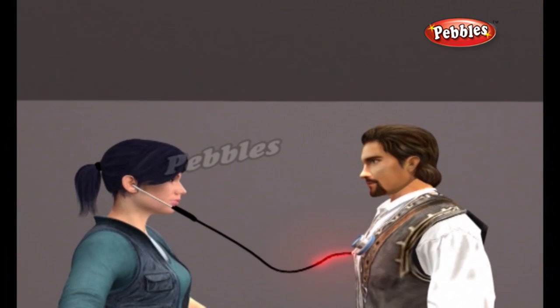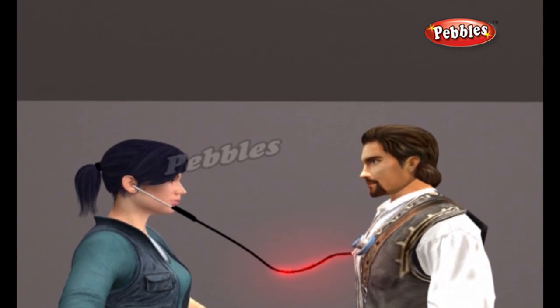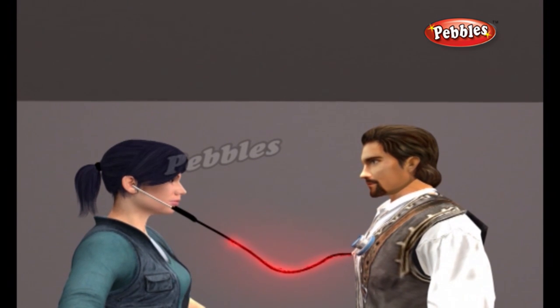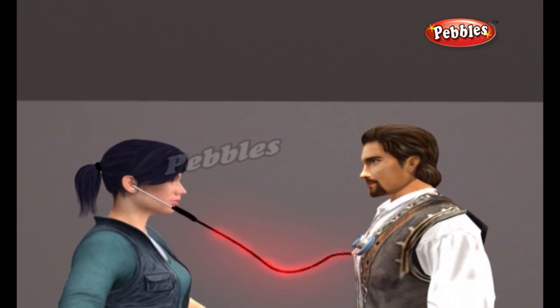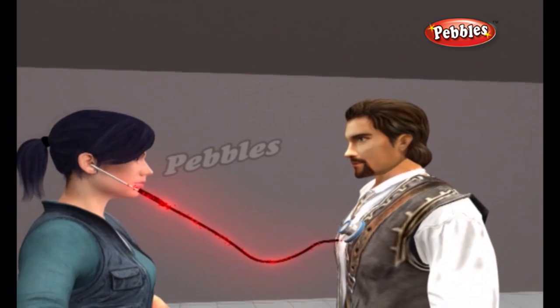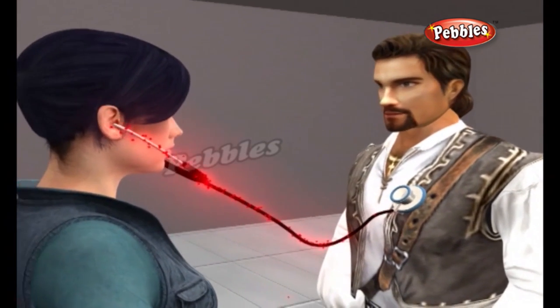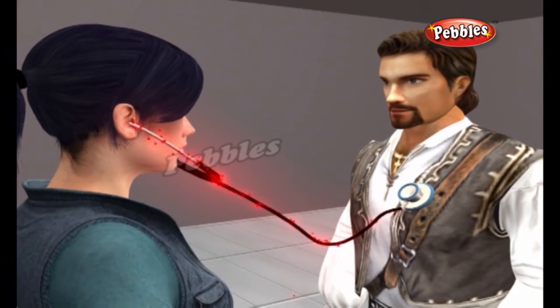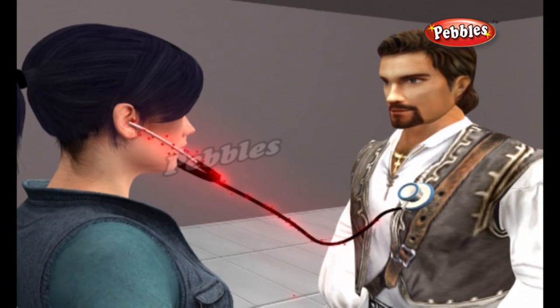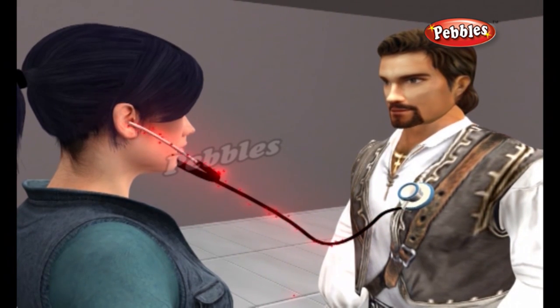When the diaphragm is placed against the patient, the sounds of the body vibrate the plastic disc and acoustic pressure waves are formed. These pressure waves travel up the hollow tubes to the listener's ears. The diaphragm side of the chest piece is useful for transmitting high frequency sounds.